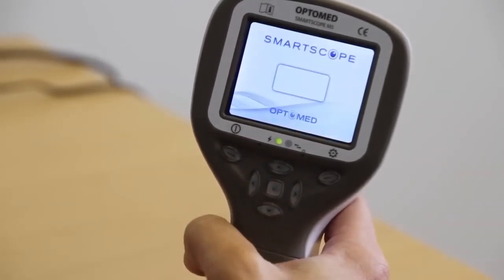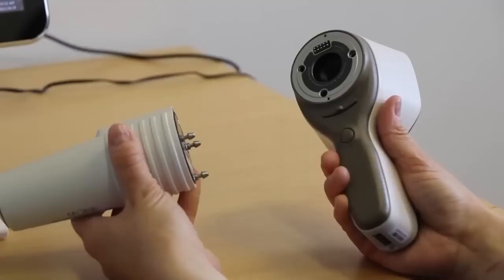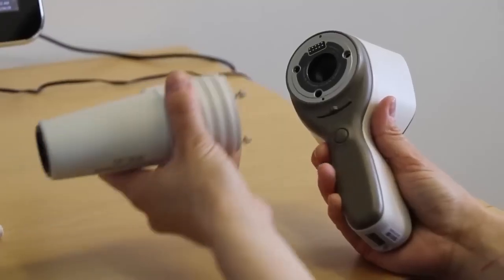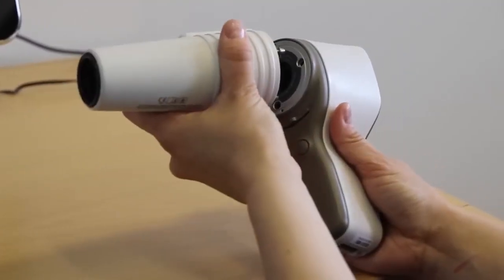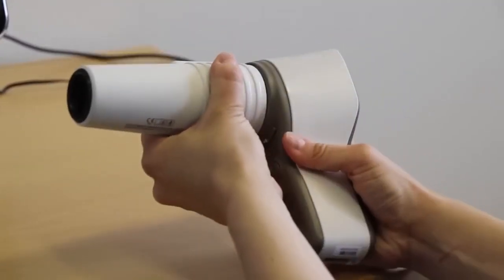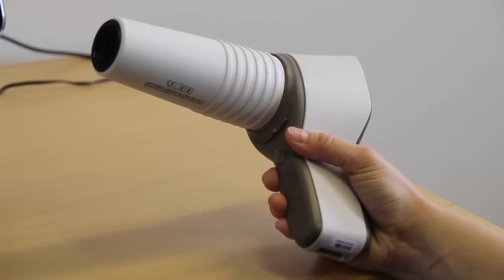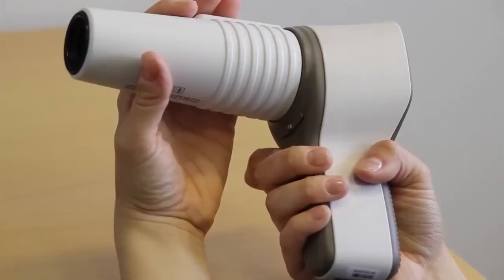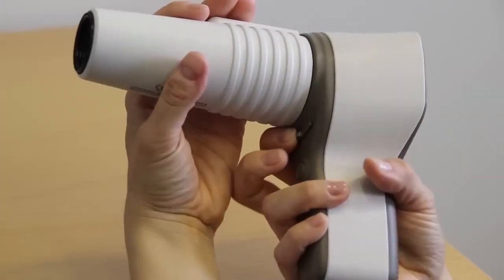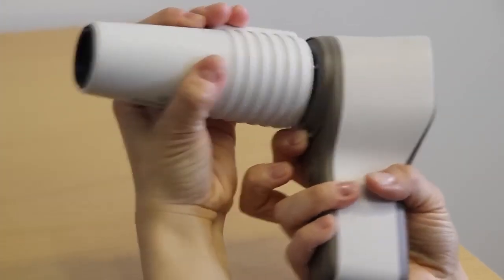Attach the EY3 Optics module by pressing it firmly into place until you hear a click. To detach the module, slide the release button.